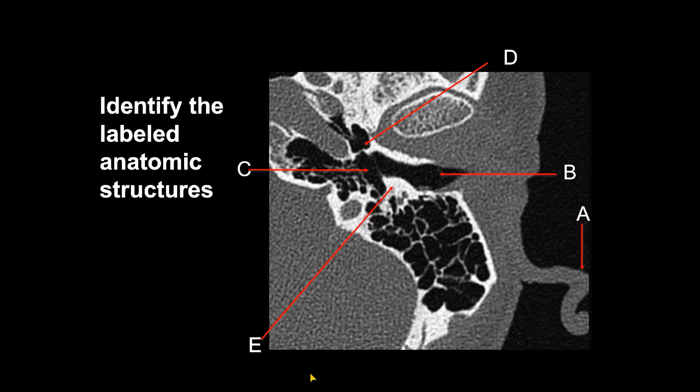On this axial CT scan in bone window, we identify A as the helix of the ear — a portion of the external ear. B is the cartilaginous portion of the external auditory canal, right at the junction between the cartilaginous and bony portions. C is the tympanic membrane — where the arrow points is actually the middle ear cavity, but you can faintly see the tympanic membrane. If you're doing CT scans two millimeters thick or less, you should routinely be able to see the tympanic membrane.